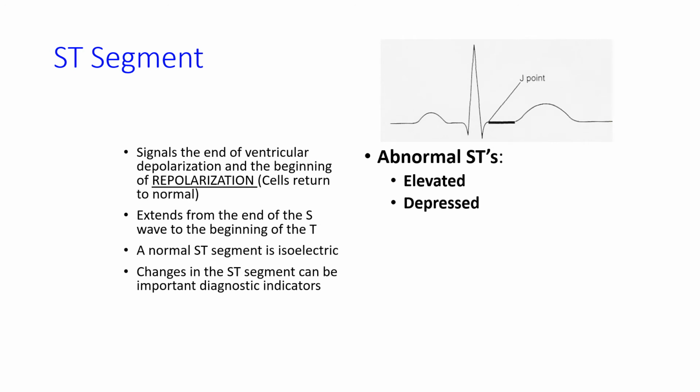Your ST segment is part of the absolute refractory period, and it signals the end of depolarization and the beginning of repolarization. So the cells are now returning back to their resting state or normal. It extends from the end of the S wave, at the J point, to the T wave. It is normally isoelectric, and changes in your ST segment can be very important diagnostic indicators. If it's ST elevated or ST depressed, that is very significant.